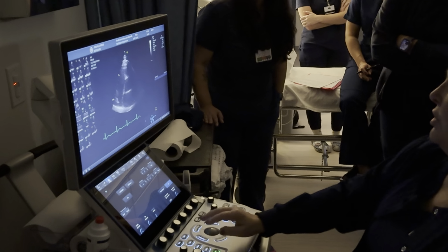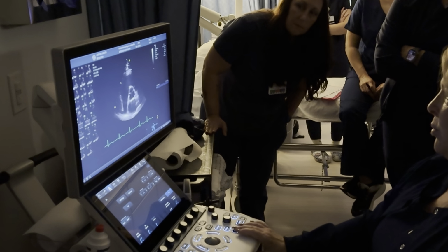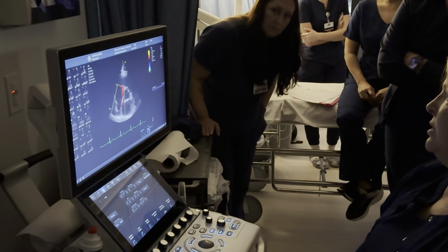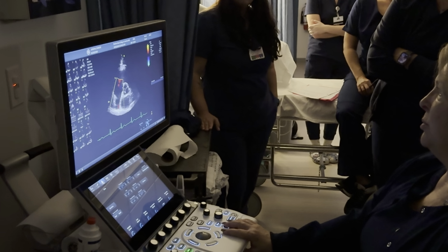I'm going to show you guys where all to put this, but I'm just kind of showing you that once you have your image, color's the next thing that we do. Little bit of TR, very tiny amount. I doubt a physician would even call it.